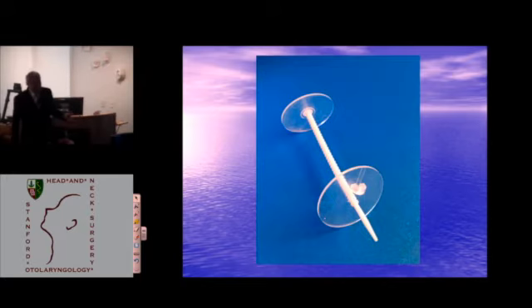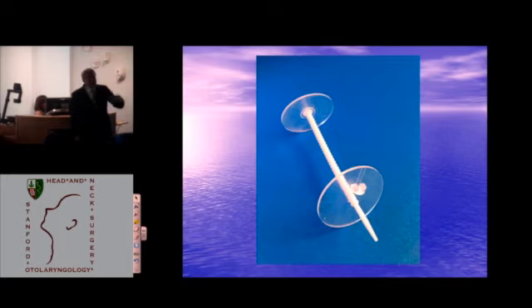Anyhow, phase two, and as a retiree, I'm in the process of putting together a multi-institutional clinical trial. Just in the early stages of negotiating with some folks who want to participate. Why? Because phase two is to wrap the stem, get it adjusted, you know your length, get rid of your leak, then take the front flange off and wrap the stem with extracellular matrix, and put the flange back on. What does the prosthesis do? The prosthesis keeps the tract and the material dry, and it keeps it in position. It's almost a scaffolding to hold extracellular matrix. So that's phase two of this project.